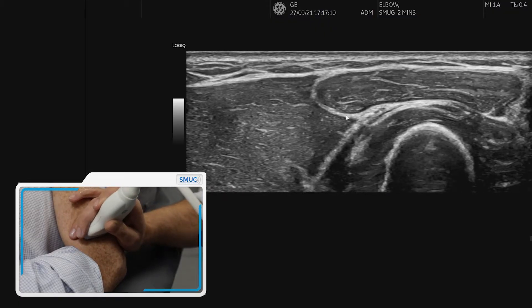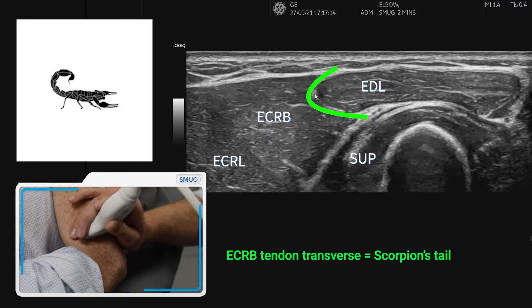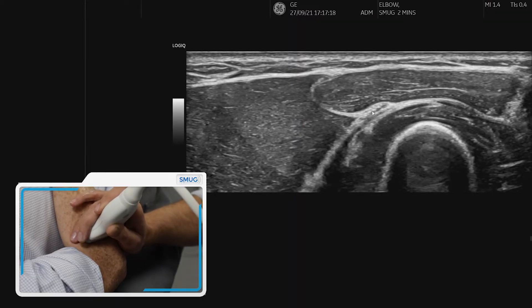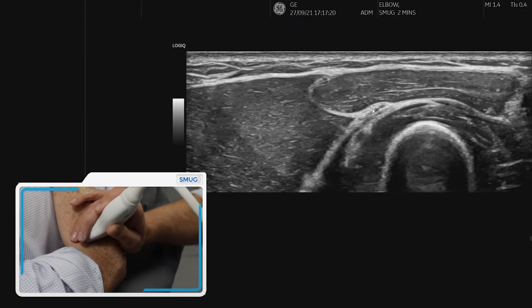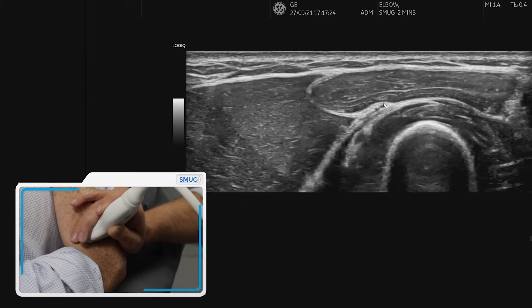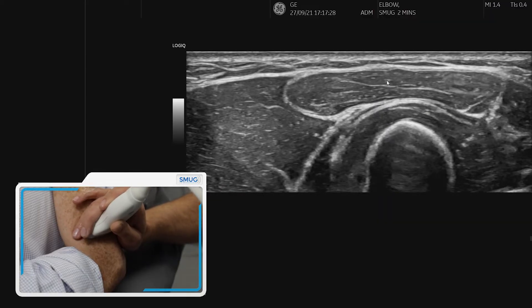Now this is a structure that we need to get familiar with. We call this the scorpion's tail, which is a nice soft tissue landmark — and that's specifically the tendon of ECRB. It sits a little bit like semimembranosus in the hamstring, underneath extensor digitorum.